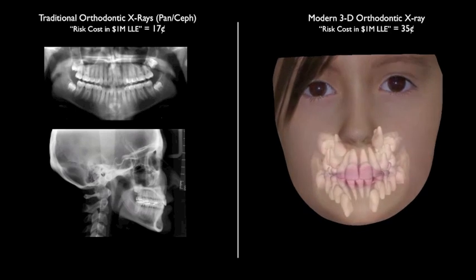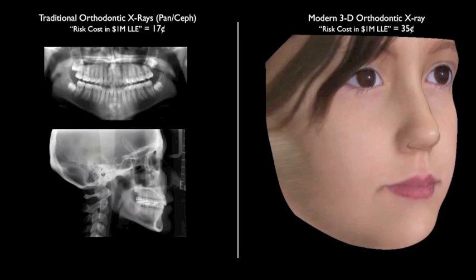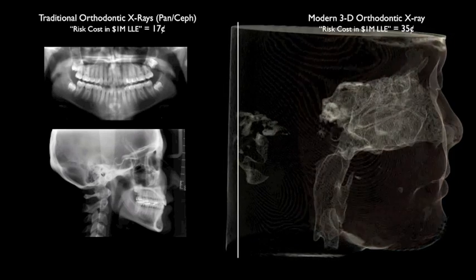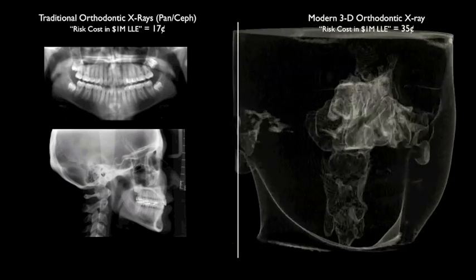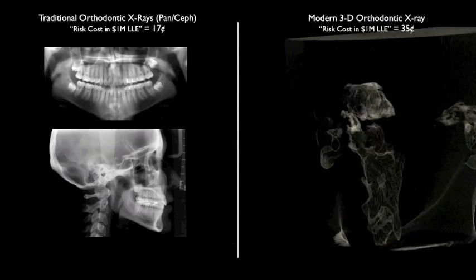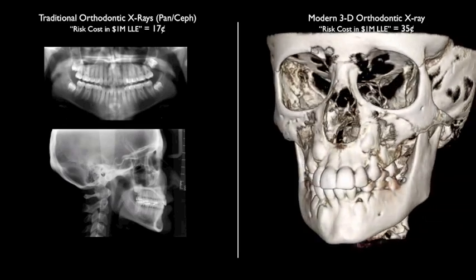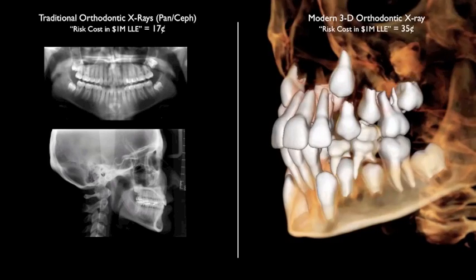So in the 80s, when I was treated with orthodontics, the exposure was probably greater than the 3D image on the right. And I believe as technology increases, these costs do come down, and so it's really just what we're looking at right now in terms of X-ray exposure in dentistry and orthodontics in particular. We're just looking at a migration to better technology, keeping the risk very minimal.